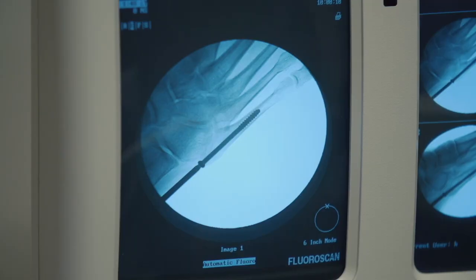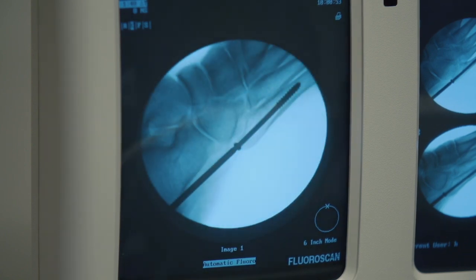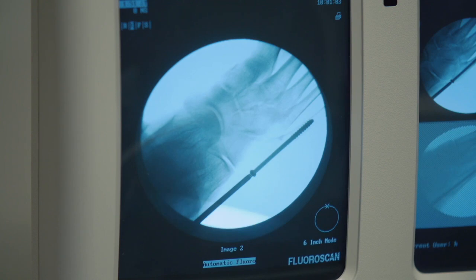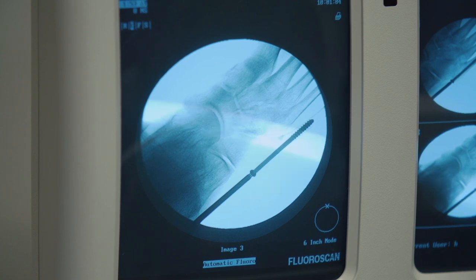Now after insertion of the screw up against the base of the fifth metatarsal, we'll get multiple views looking at our AP to ensure we haven't fractured through the medial cortex. We'll obtain a lateral image to ensure that we're midline in the fifth metatarsal. Especially on the AP view, this is the proper width of the screw as confirmed and made much easier utilizing our new targeting guide.